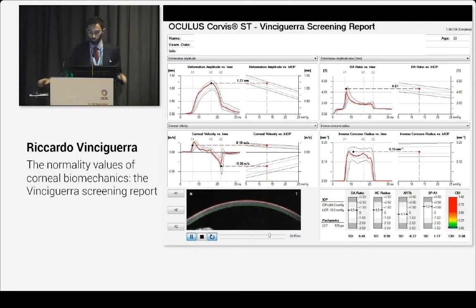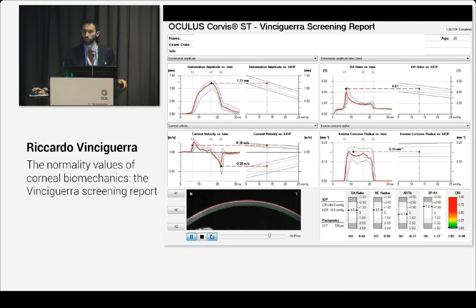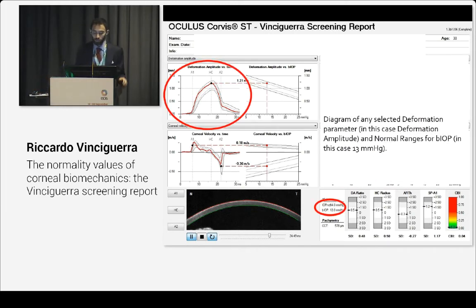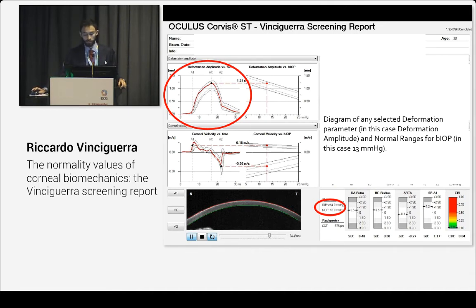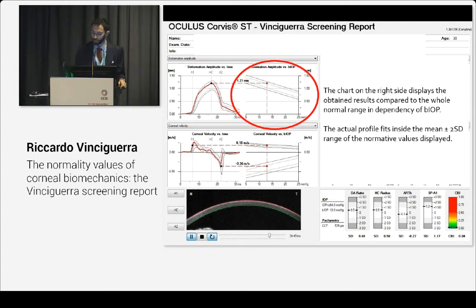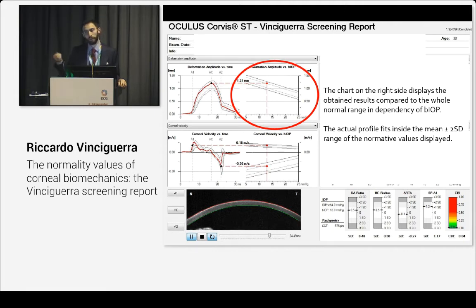This is how the display looks. You will have four different parameters that you can select. You will have a diagram on the left of any selected deformation parameter and the normal range for that particular BIOP of the patient — in this case, 13 millimeters. On the right, you see a chart which displays the obtained results compared to the whole normal range in dependency of the bIOP. You can see that this patient fits inside the mean plus or minus 2 standard deviations, so it's normal.